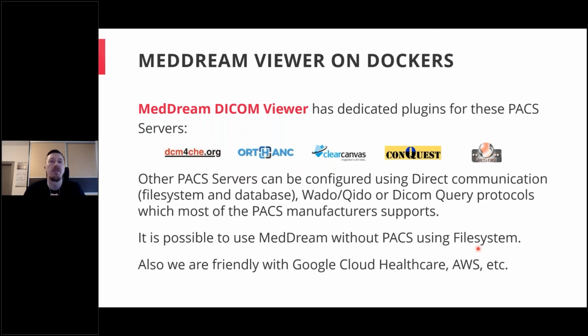And of course, now the clouds are the trending one. So we are friendly with Google Cloud, Cloud Healthcare, and other services. So just in case you are planning to use this, also let us know, and we will be happy to help you configure it and test it.